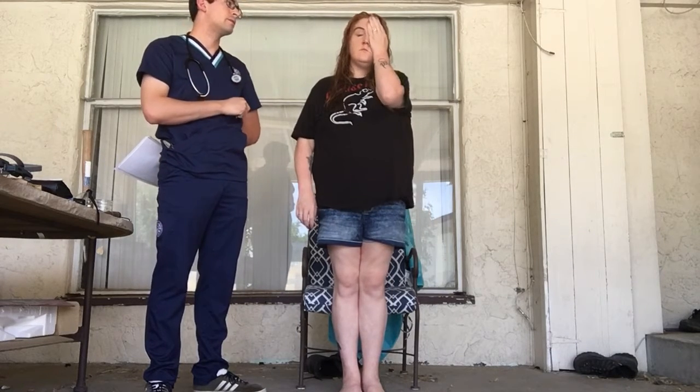Alright, can I have you stand up? Do the Snellen eye exam. So I'm going to have the patient stand 20 feet from the Snellen chart, and I'm going to ask you to read starting from the top line from left to right. Normally I do this with both eyes, then one at a time. I'm just going to do it one at a time. Can you cover your left eye? And start from the top line, left to right.